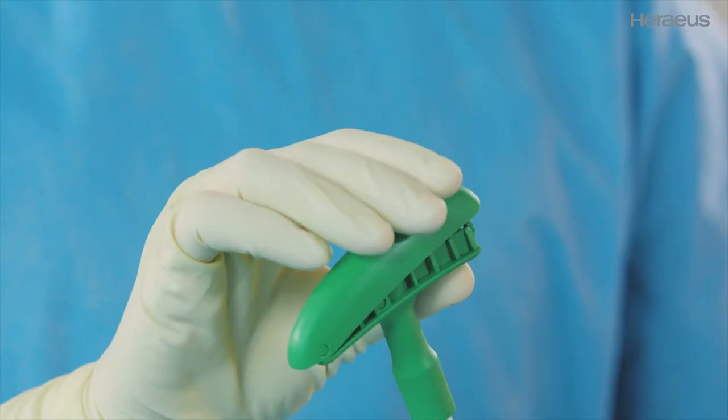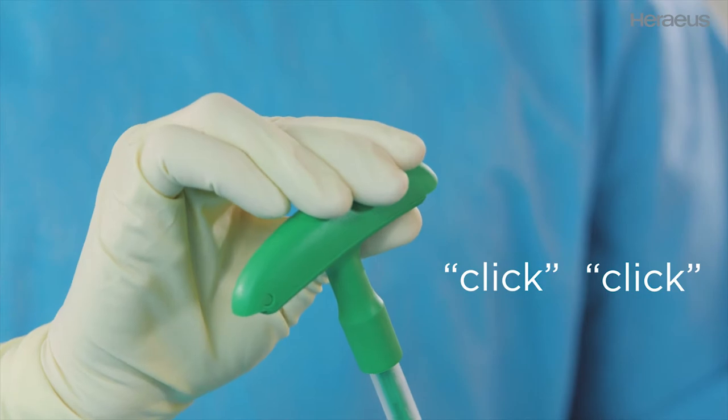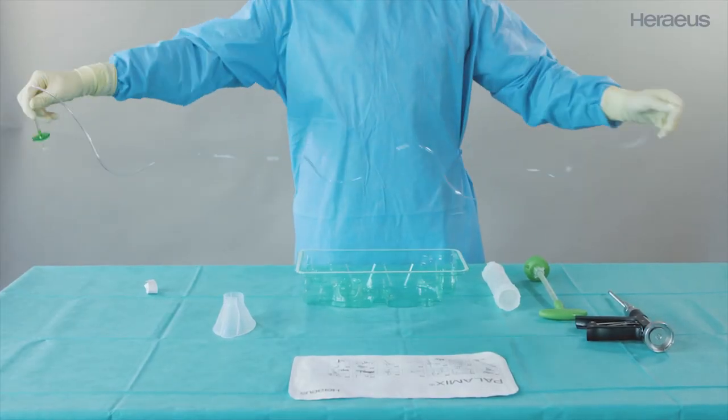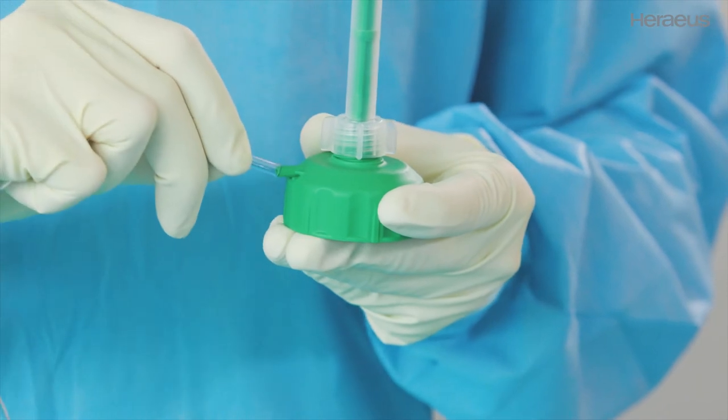First, close the handle on the mixing rod — two clicks are heard. Then remove the vacuum hose and connect it to the cap of the cartridge.